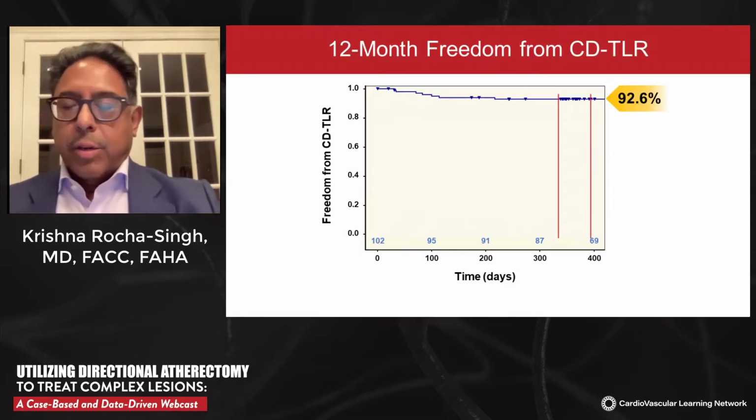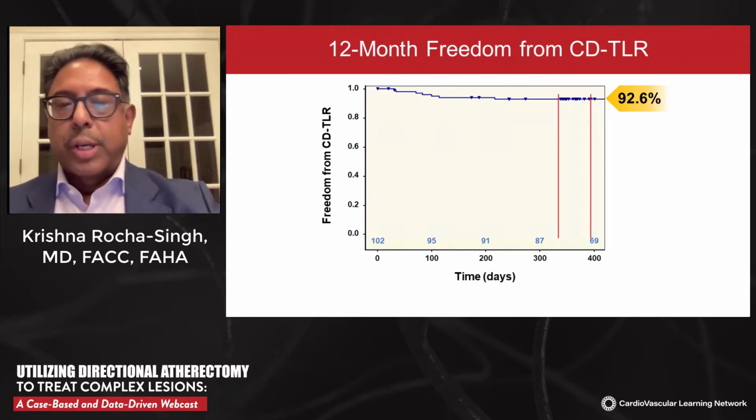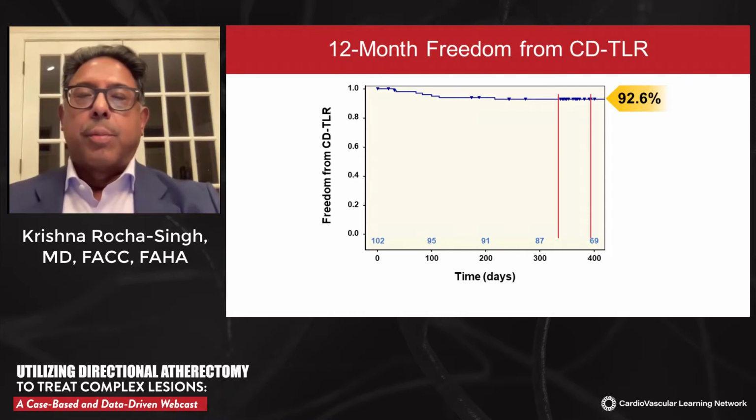When we look at clinically driven TLR through 12 months, we note a freedom from clinically driven TLR of 92.6%. Again, suggesting at 12 months a very good clinical response to this therapy.